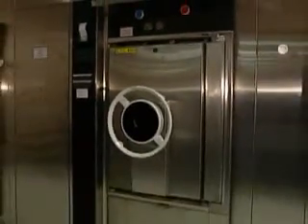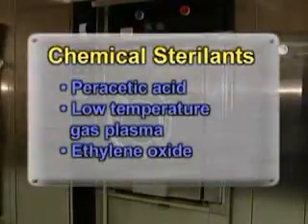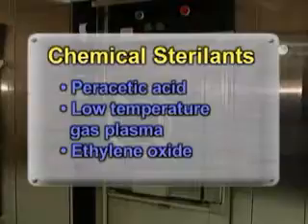For critical items that are heat sensitive and that can be immersed, the FDA has approved chemical sterilants as a method of sterilization. These chemical sterilants include peracetic acid, low-temperature gas plasma, and ethylene oxide.